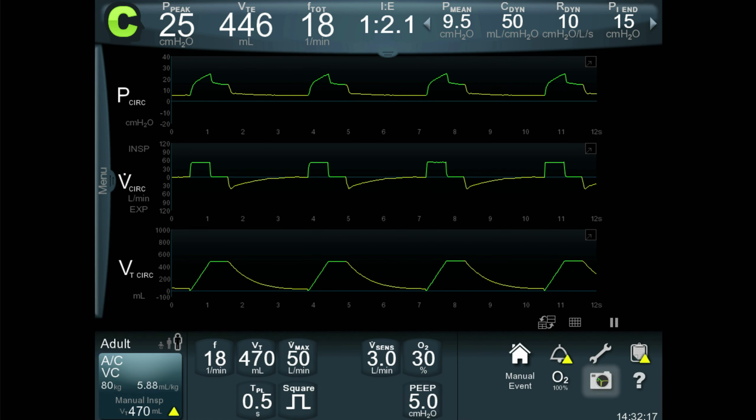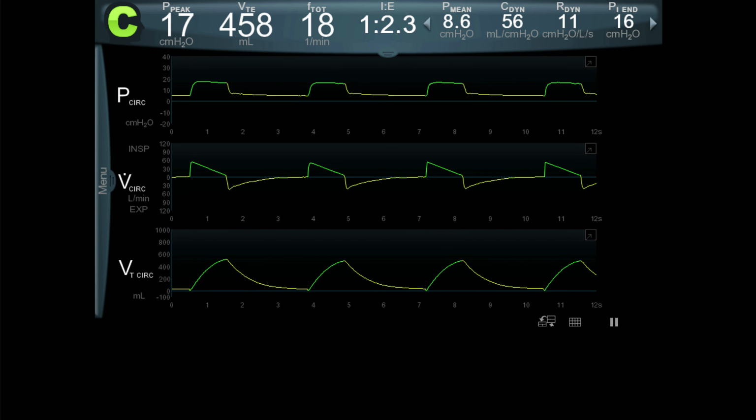Well, this is volume assist control, although you don't know for sure because all you're seeing here is controlled breaths, but it's definitely volume control because of the constant flow waveform. There's an inspiratory pause, there's a peak and plateau pressure, and the tidal volumes are locked in. They're all exactly the same. So volume assist control, constant flow pattern, inspiratory pause. What about this one? Pause the video for a moment, have a look at this, tell me what you think.